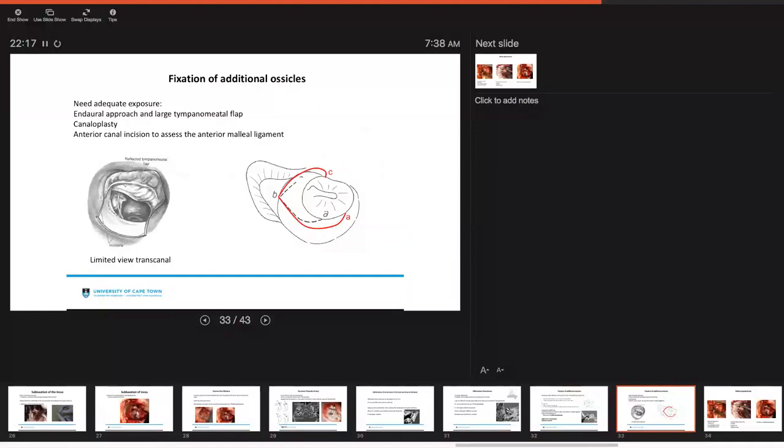If you're going to address additional ossicular fixation you really do need good adequate exposure. We prefer to do an endaural approach with a nice large tympanomeatal flap. You may consider doing canaloplasty and you also want to do an anterior canal incision to assess the anterior malleus ligament.